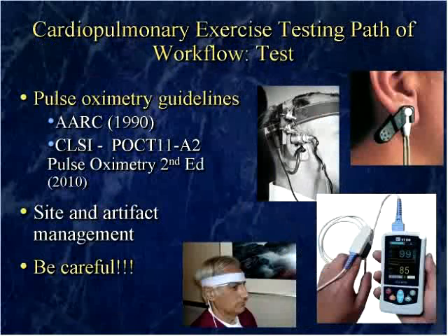The big thing with exercise testing is that everything goes to core when you exercise, so the periphery, blood circulation kind of constricts down because your body wants to make sure that the blood is going to the major muscle groups and the legs and staying within your core. And where do we measure pulse oximetry? We measure it in the periphery. So make sure that you have a variety of probes. Make sure if you're using a finger probe or an ear probe that you rub that side up before the test and during the test, so that you get rid of the opportunities for false positive results.